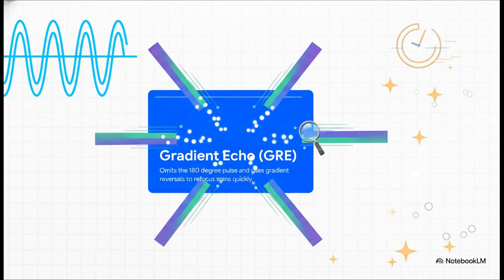This sequence completely ditches that 180-degree turnaround pulse. Instead, it uses magnetic gradient reversals to refocus the spins. By skipping that extra 180-degree pulse, the scanner doesn't have to wait nearly as long, making the whole process incredibly fast. The catch? Because it doesn't actively correct for slight imperfections in the main magnetic field, it's highly susceptible to what we call T2 star effects.